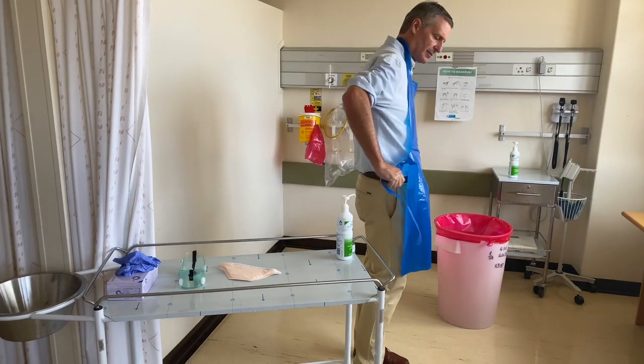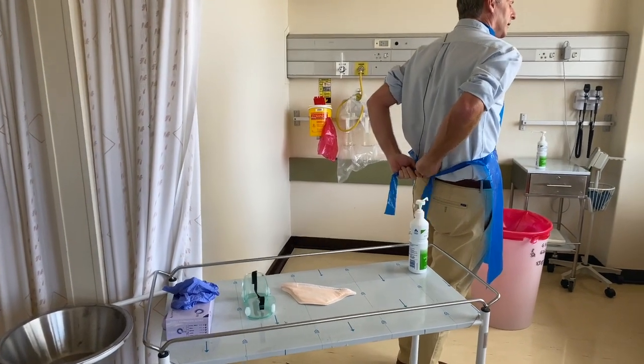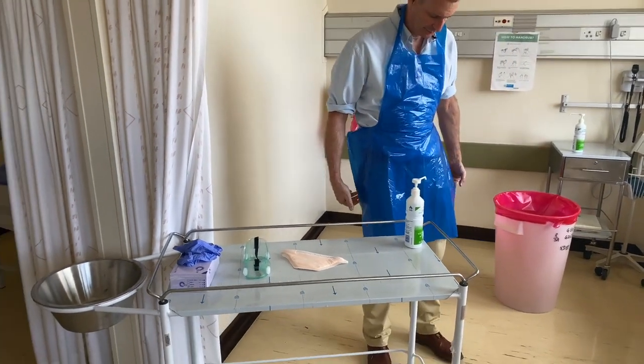I'm going to take the ties and tie them just behind my back, making a very loose bow which can either be undone or ripped when I'm taking it off.